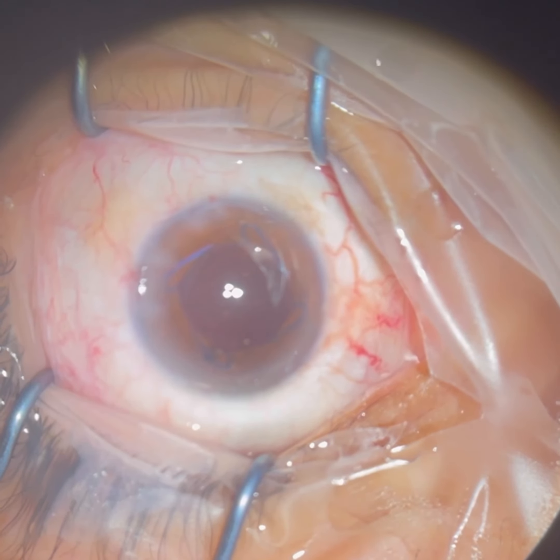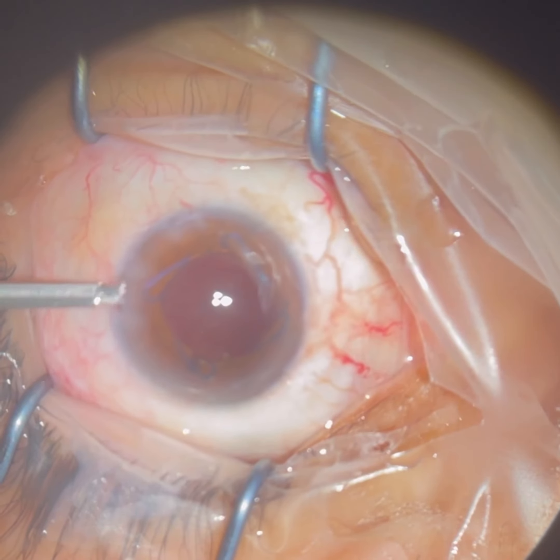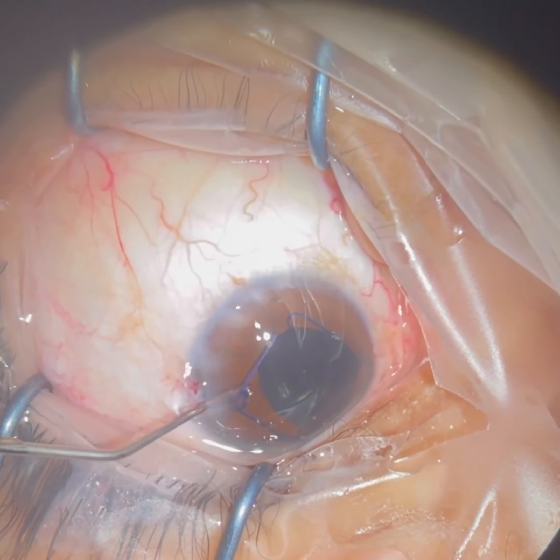Here we just injected the lens, which you saw came in all folded up. When we inject it in the eye, it unfolds. We put it back into the capsular bag, which is where the old cataract was.